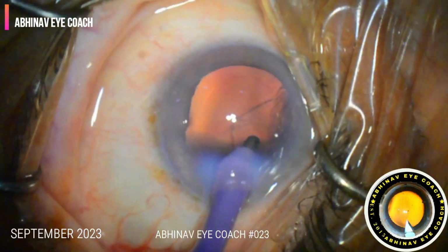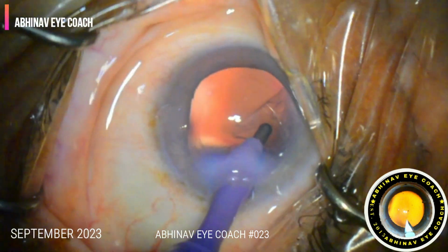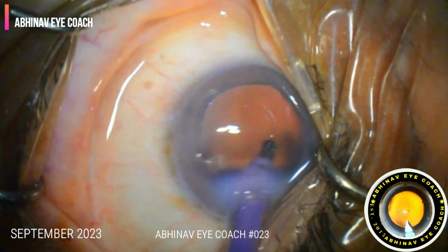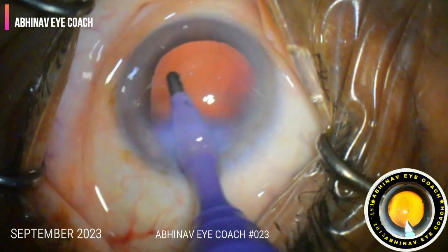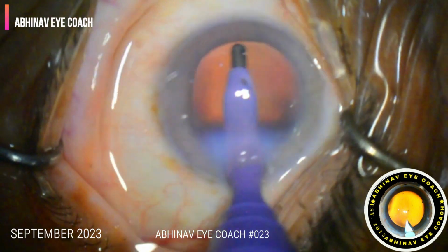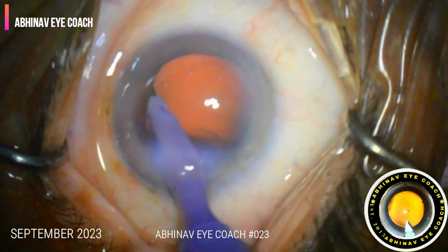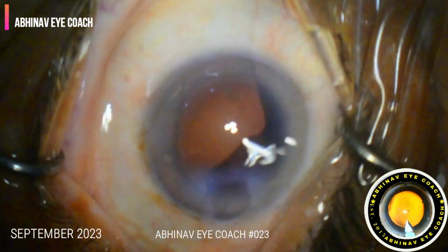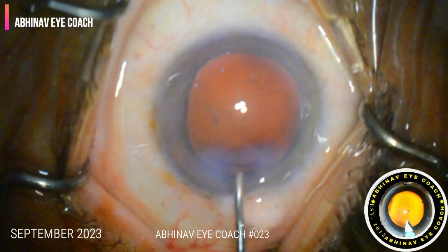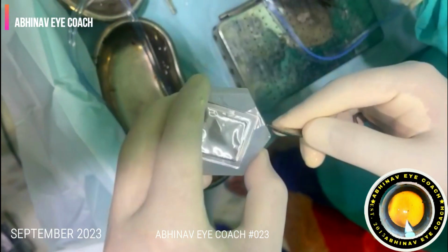In this case, we can see because of hydration of stroma, the main port is swollen and edematous. It happens because of leakage of fluid into the stroma of the cornea, but it easily subsides within a few hours after the surgery. Again, viscoelastic is injected.